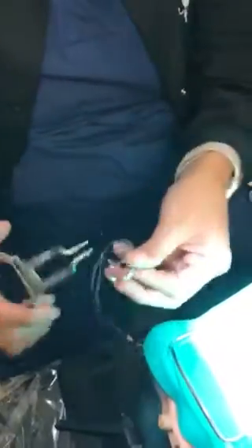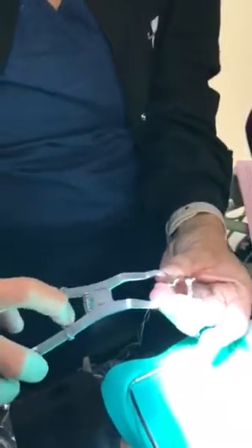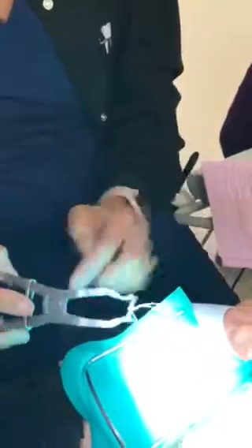So I'm going to get my clamp and my forceps. When you're using the clamp, the little 2 notches are going to go into the holes, and you always want the bow up. Okay, so this bow is going to go opposite this hump over here, and then I just kind of pull it tight to open it a little bit. I don't want to pull it too wide or it's going to stretch out the clamp, but just enough to go over the teeth. The bow is always going to go towards the posterior part of the mouth, because if I put this on this way, it's going to be in my way if I'm working on these anterior teeth. So the bow is going to go towards the posterior.